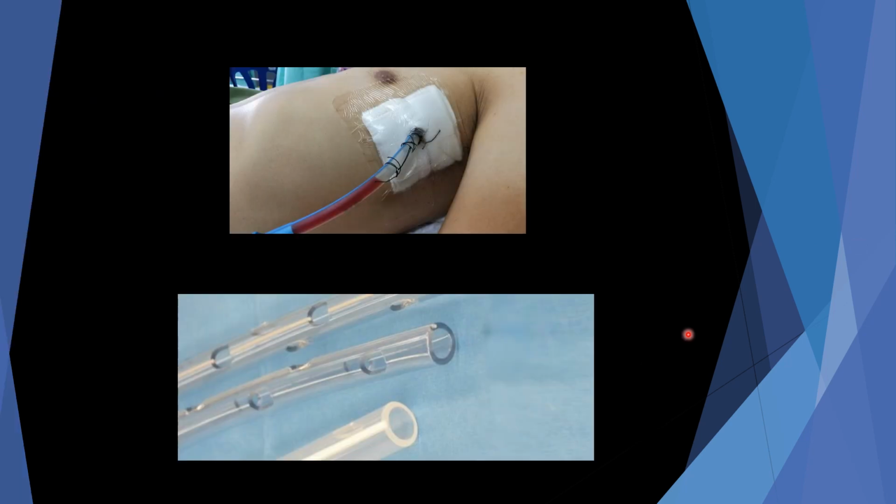All right, here's a picture of the actual chest tube. These are the average size that you're going to see within the ICU. Again, you may see some smaller ones, but this is mostly what you're going to see. If you're ever down in the emergency room and a patient comes in, this is what you're going to see, and you may even see something pretty large. As you can see, it's a pretty large diameter, and this chest tube is this size all the way up, high up into the apex of that lung. And there's the nipple site, which is our landmark to get between that fourth and fifth intercostal space.